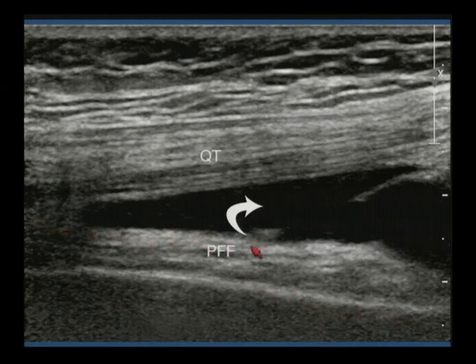Here's the prefemoral fat, and now we have a reasonably large triangular area in the suprapatellar bursa. It's pretty much uniformly hypoechoic. There's one or two little fronds here and there, but it's pretty much uniformly hypoechoic. So this is fluid, and this will be compressible on ultrasound. This is fluid in the suprapatellar bursa. So that's a moderate-sized effusion.